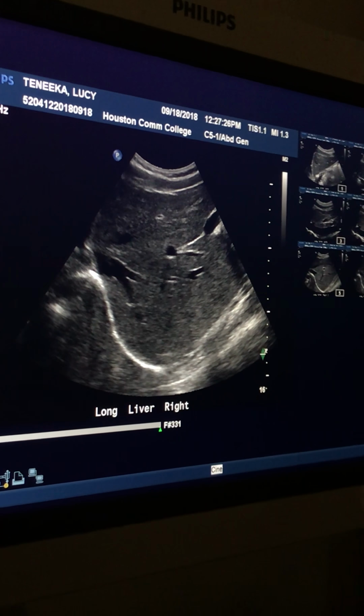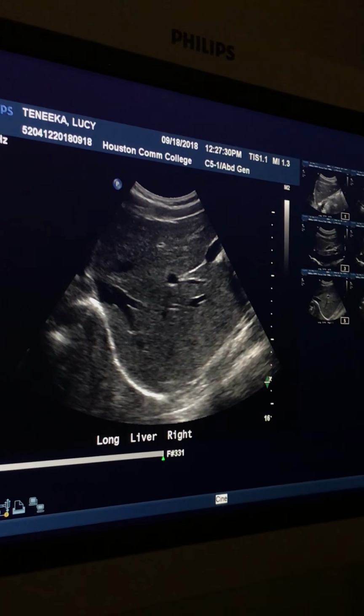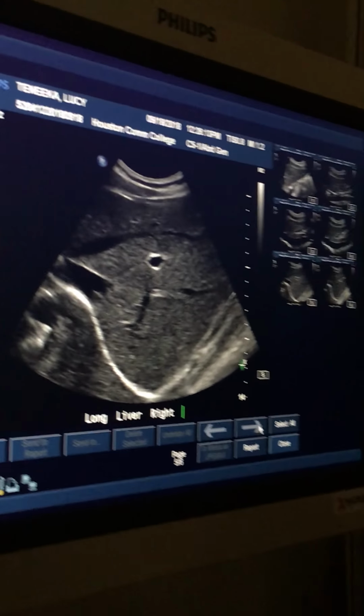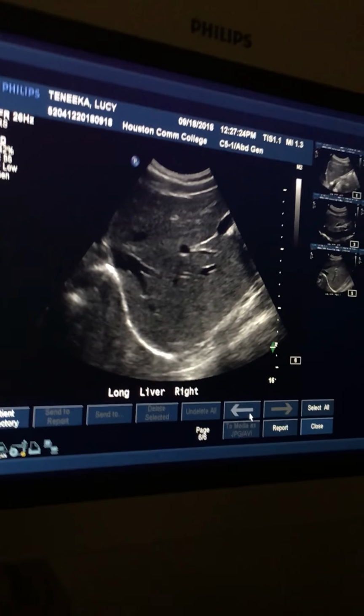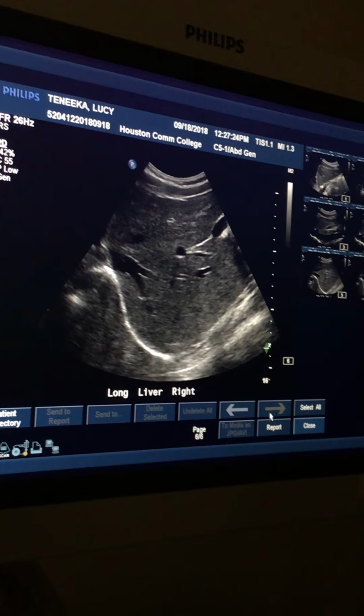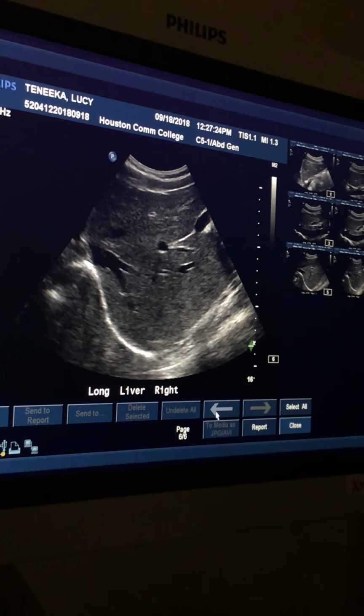The upside down peace sign that she's throwing up, that's hepatic. So this picture and this picture are both right portal vein. It just looks different, right? And that's fine. Either one is fine. But yeah, she's starting to throw some hepatics there.